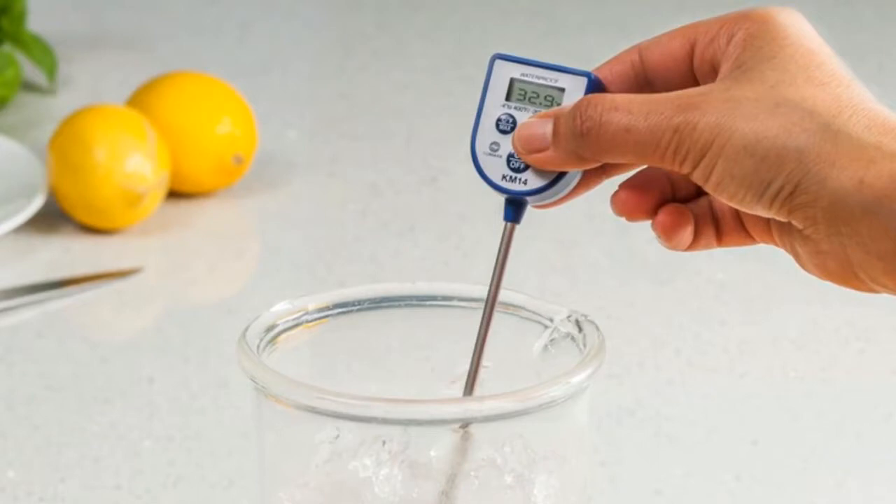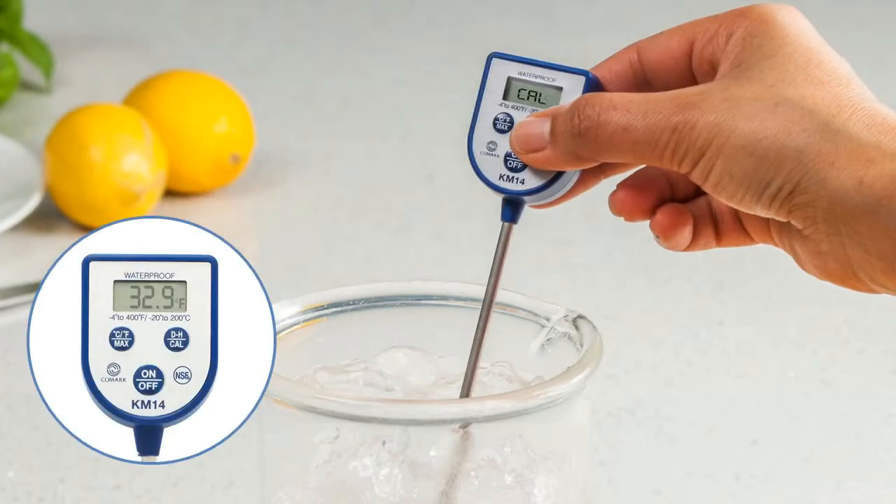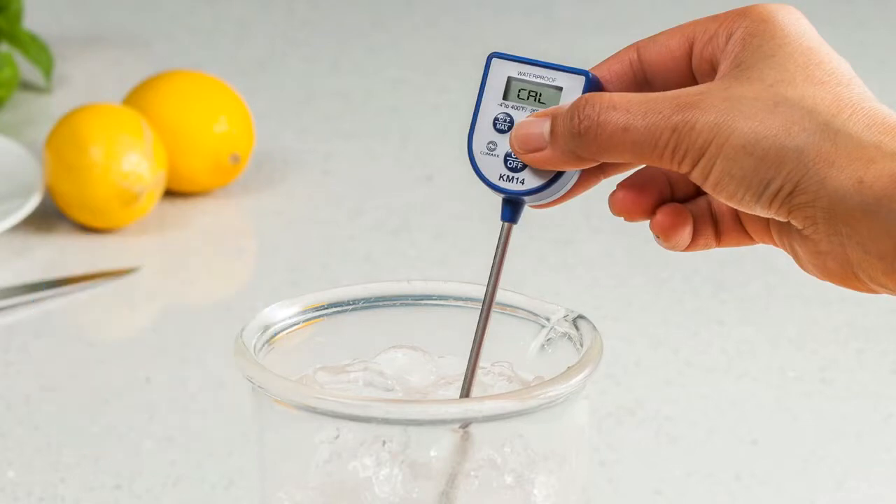To begin calibrating your pocket digital thermometer, you should press and hold the CAL button for 8 seconds. On devices that don't have a CAL button, the DH or data hold button is usually used instead. The digital display should show the CAL message for around 2 seconds, after which the recalibration to 0 degrees Celsius or 32 degrees Fahrenheit will have been completed.